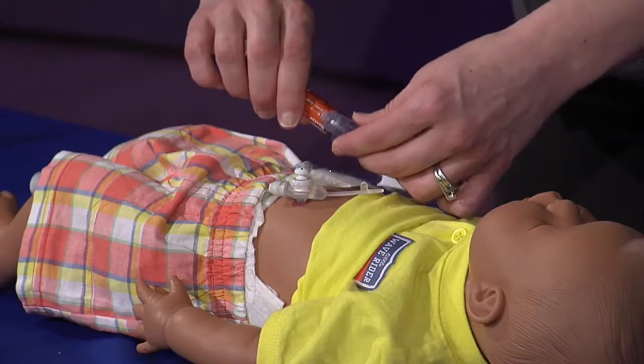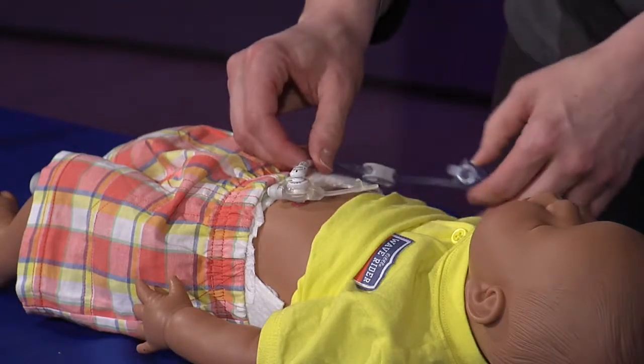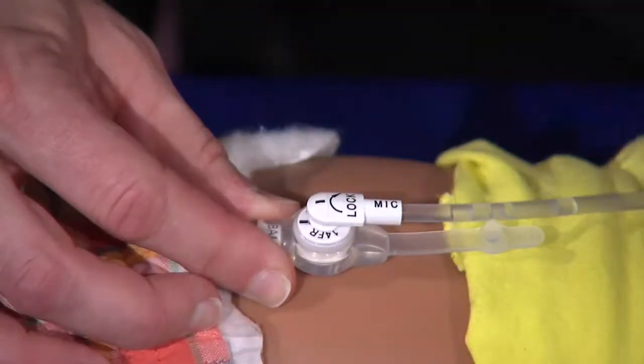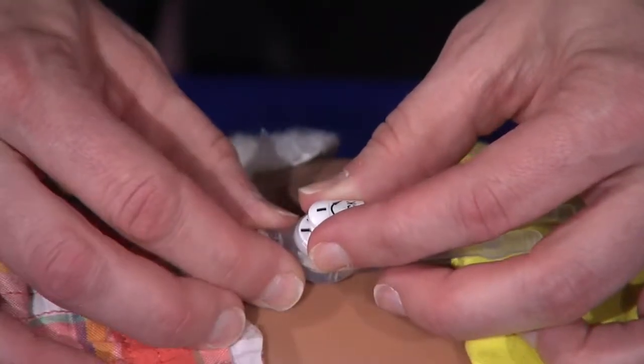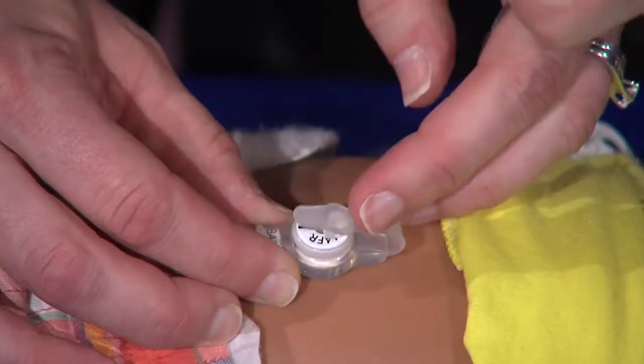Be sure to disconnect the extension tubing when it is not in use. You will need to turn the extension tubing the opposite direction of the arrow until the two black lines line up. Again, support the button with one hand as you gently pull the extension tubing out with the other hand. Be sure to plug the button.